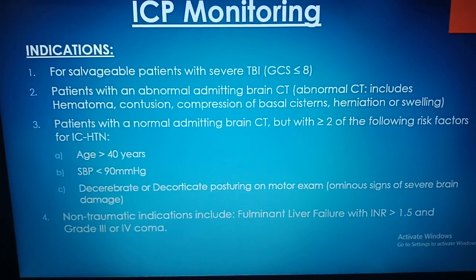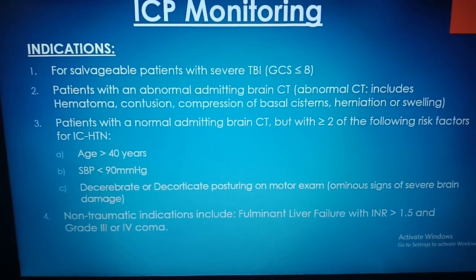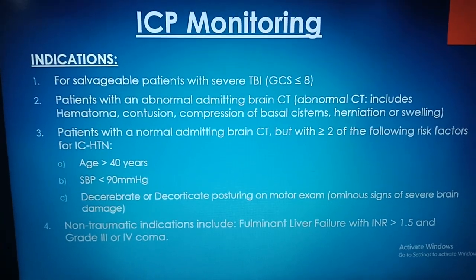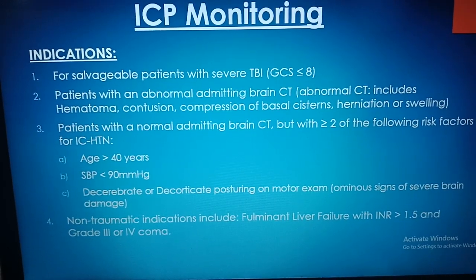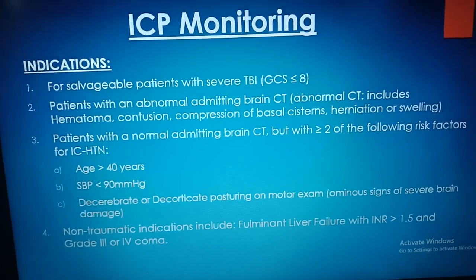Number 4 is the non-traumatic indications. Now, all of this time we have been discussing the traumatic causes of intracranial hypertension, but there are some non-traumatic indications of ICP monitoring, which include fulminant liver failure with an INR of more than 1.5 and grade 3 or 4 coma.